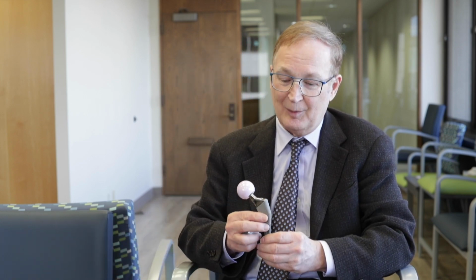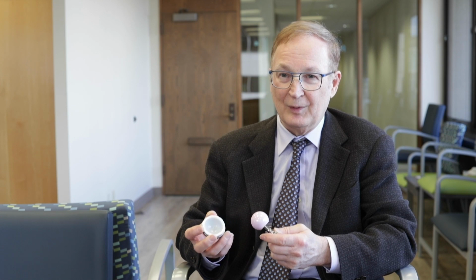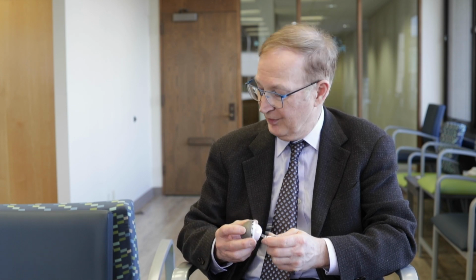Because of that, we tried ceramic balls, and this is a Delta ceramic from Germany, again on a titanium stem. The socket has the same titanium backing, and it has a polyethylene interface. This interface could be also ceramic if one chose, or different other polymers, but polyethylene's been the most common. Trouble is that even though titanium is a little less reactive and a little softer than either stainless steel or cobalt chromium, patients, if they're very metal sensitive, still react to it. It hasn't been a full answer.